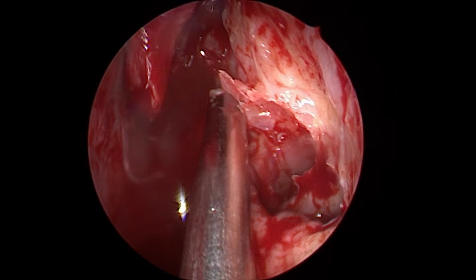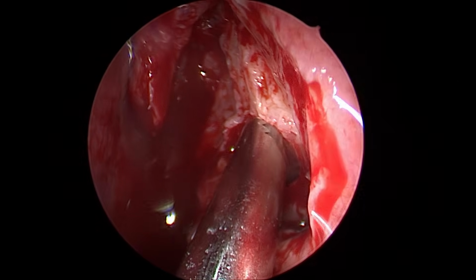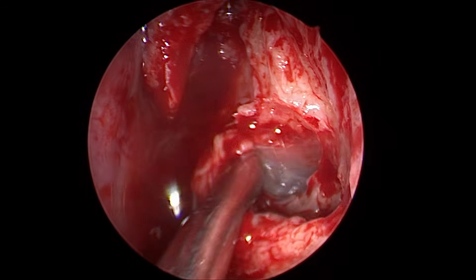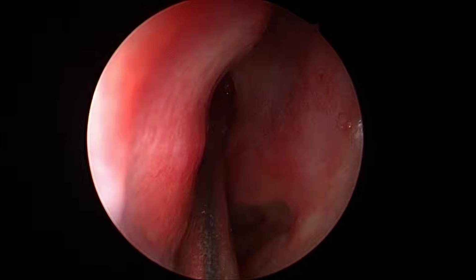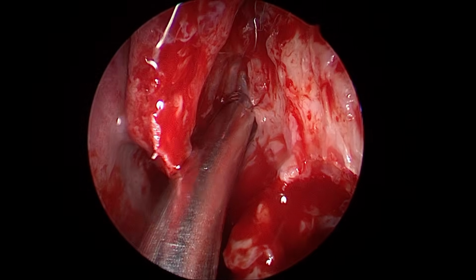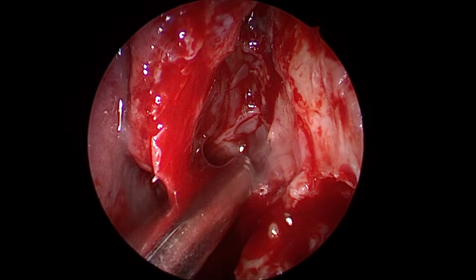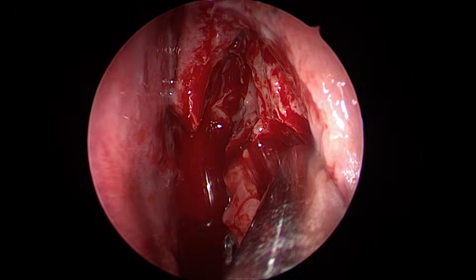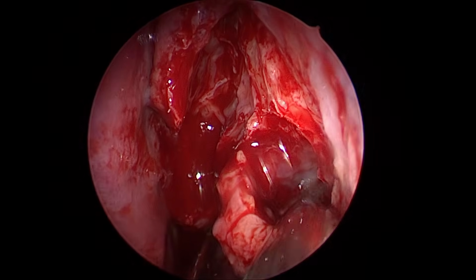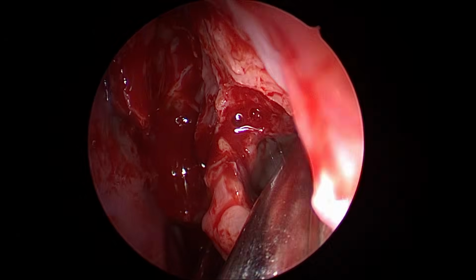Sometimes too much inflammation, eosinophilia, affects the underlying bone and presents as osteitis. Osteitis is a bad bone which is full of depot of inflammatory cytokines, and that bad bone doesn't allow the antibiotics to penetrate, and you have to radically remove the osteitic bone. See my maxillary sinus from inside, the kind of disease there.